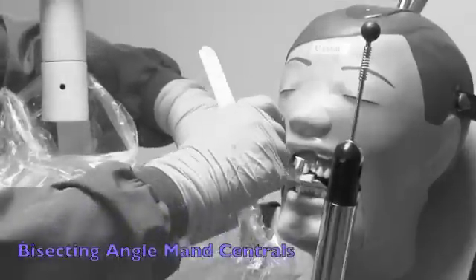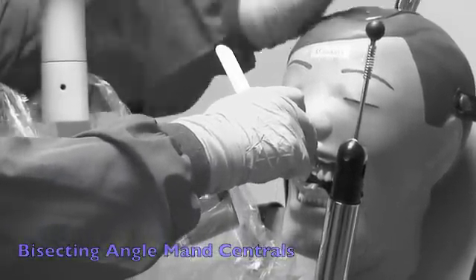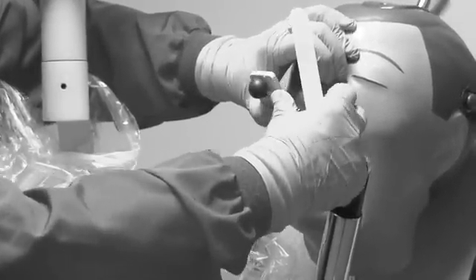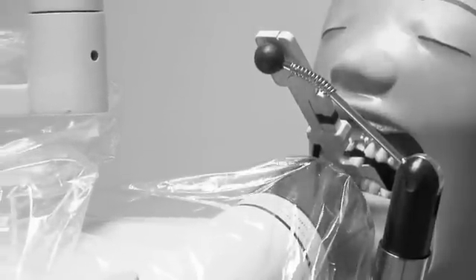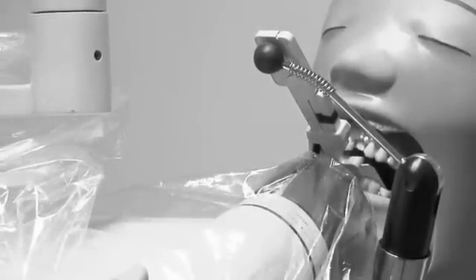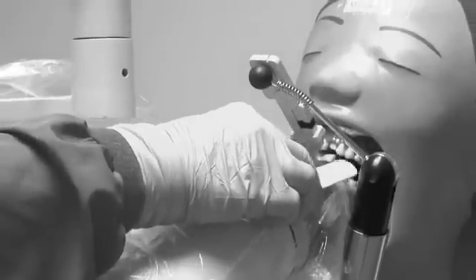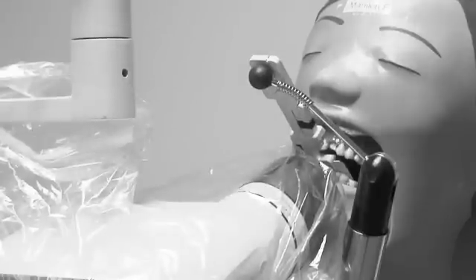For the mandibular centrals, the film is placed the same way. Pull the film nice and tight against the teeth and have the patient hold it towards their nose. Cup the chin a little bit so the PID comes right behind the border of the chin, the mandible. Check the top of the film so that it's covered by the PID, and you will not cone cut.